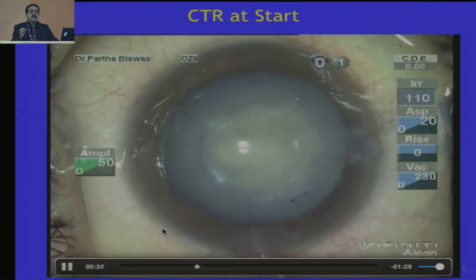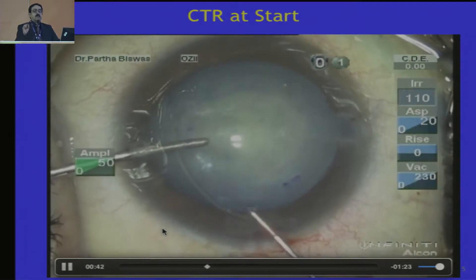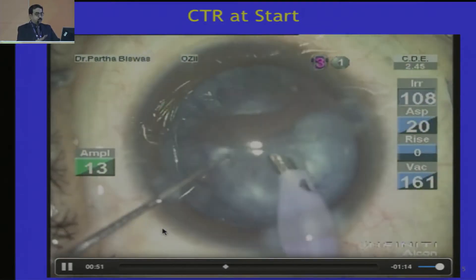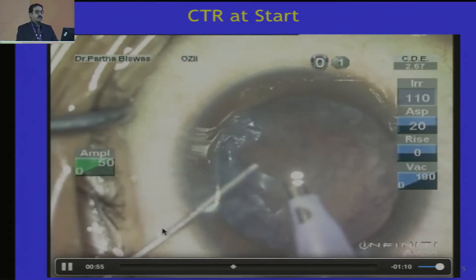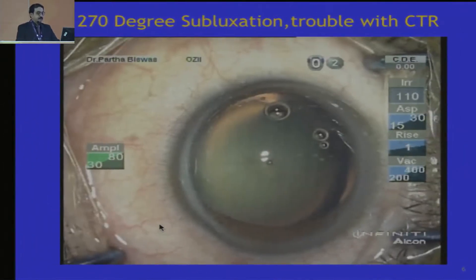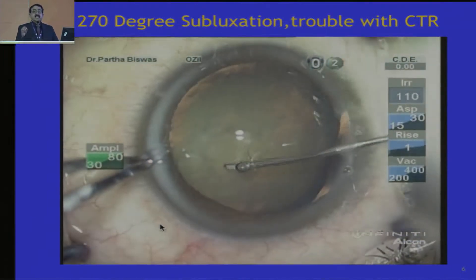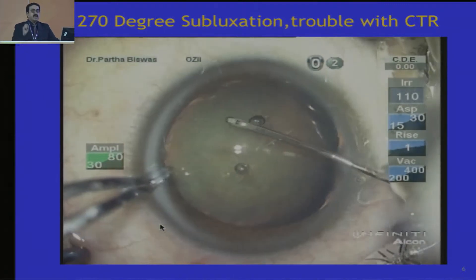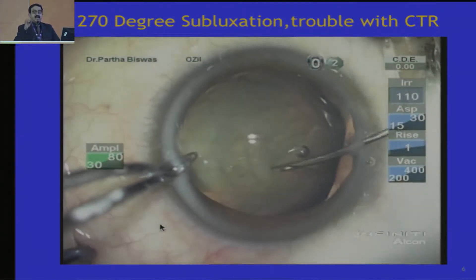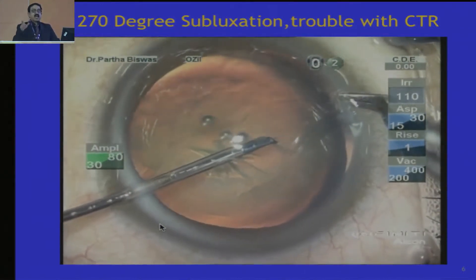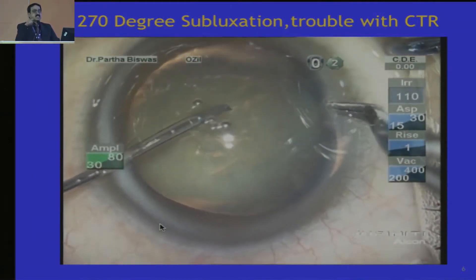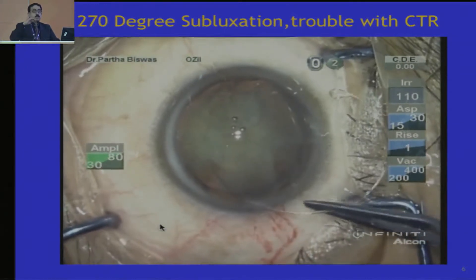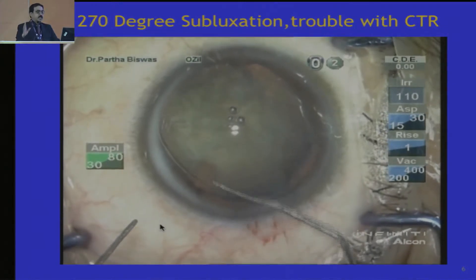The capsulorexis is one of the most important aspects of doing cataract surgery in the subluxated lens. We can see that we have placed the CTR in the bag and it has gone in very smoothly. Your triumph depends upon whether you have done a good capsulorexis. You must have at least a 4 mm clear of the subluxated area. Center the capsulorexis on the subluxated lens and definitely not on the pupil, so that you have a very good rim of anterior capsule when putting in your lenses and devices.